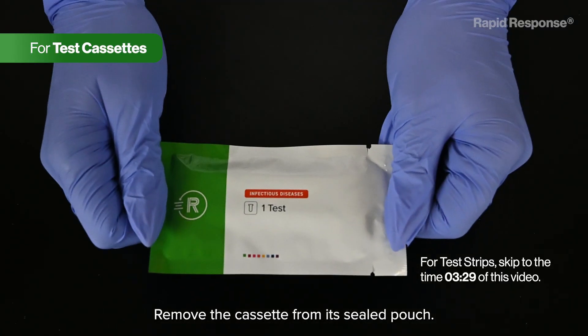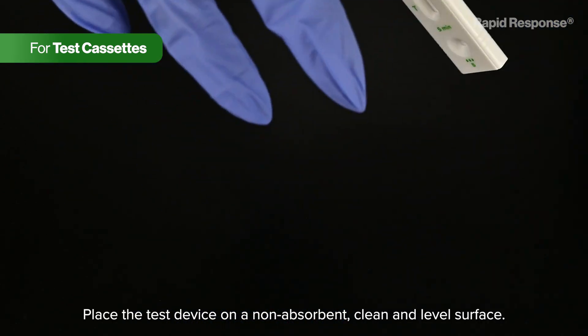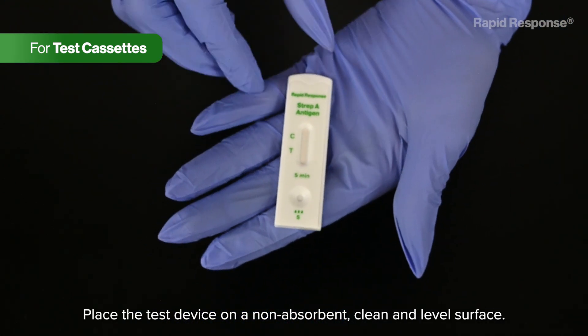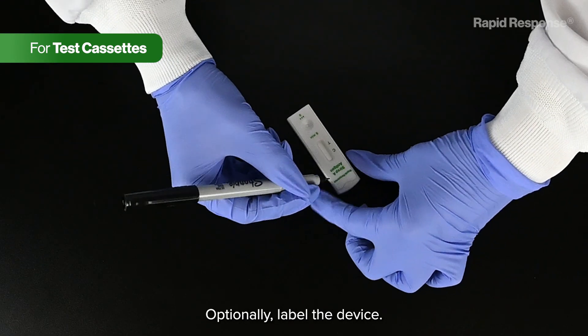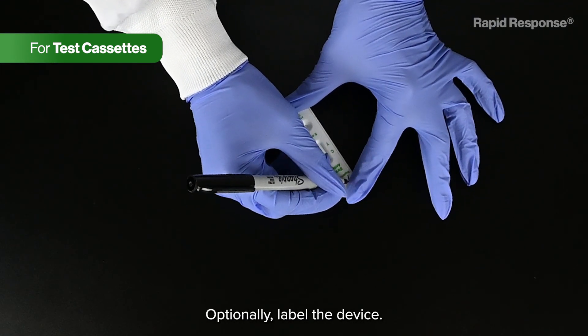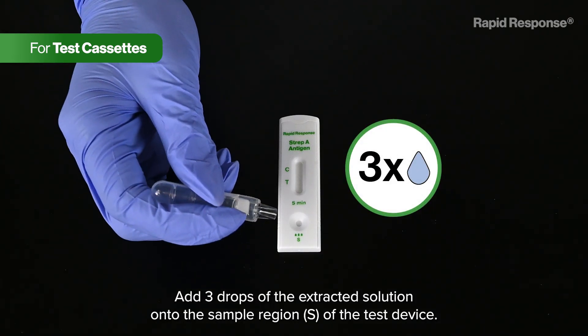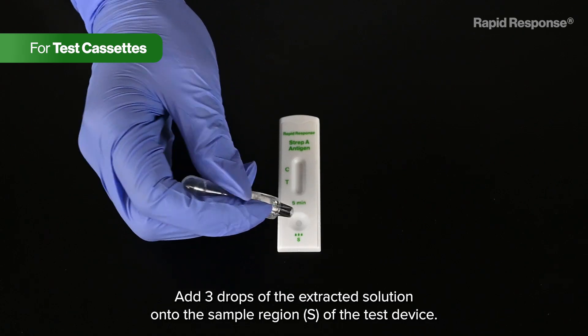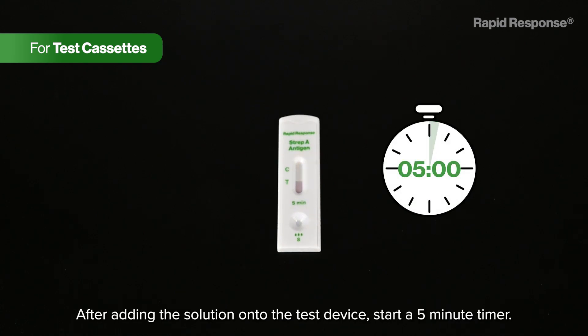Remove the cassette from its sealed pouch. Place the test device on a non-absorbent, clean and level surface. Optionally, label the device. Add three drops of the extracted solution onto the sample region of the test device. Avoid trapping air bubbles in the specimen region and do not add any solution to the results region. After adding the solution, start a five-minute timer.